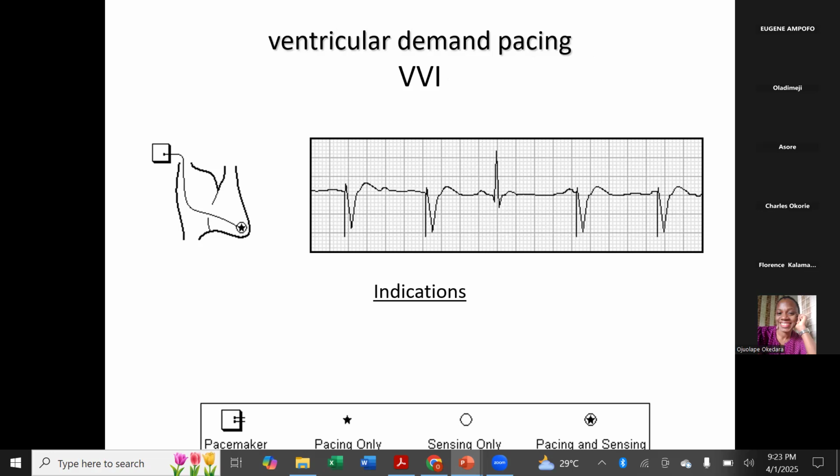Okay, so let's see the difference between that first ECG and the second ECG. So this second ECG is a patient where you have intrinsic activity. So let's take it from the beginning. We're only seeing one pacemaker spike, right? In front of the QRS. Okay? And intrinsic activity is there, and you do not see any pacemaker spike around it. So seeing one pacemaker spike that is generating QRS, paced QRS, that tells you that you're only pacing the ventricle. We have not seen any other pacemaker spike in front of the atrium. So likely it is just a single chamber pacemaker.